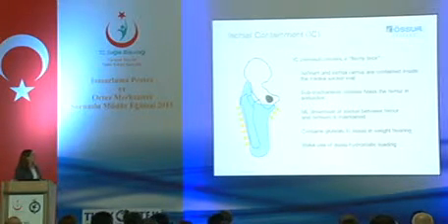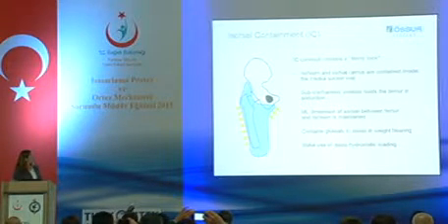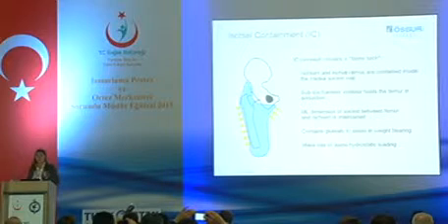When we look at the ischial containment type of design, this design creates a bony lock with the anatomy that we have available.